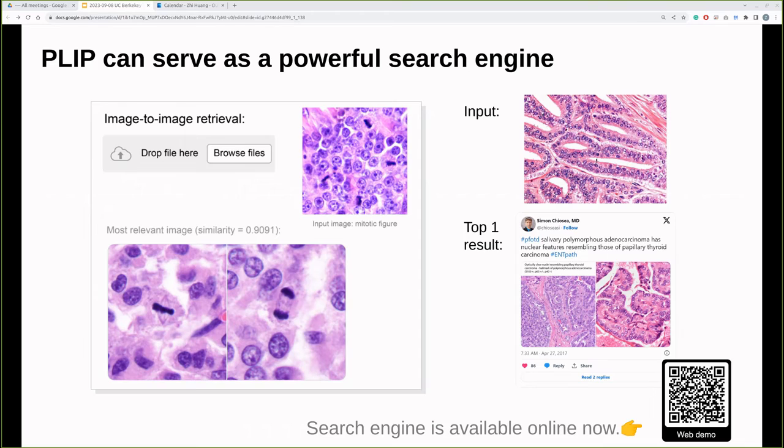This is a really great point. We are actually thinking about it the same way. My other ongoing project right now is trying to use cell-level features to quantitatively provide better measurements for different staging and also disease types. So rather than a subjective gut feeling or ranking, we instead use a quantitative approach to separate those different subtypes. Yeah, so that's very interesting.